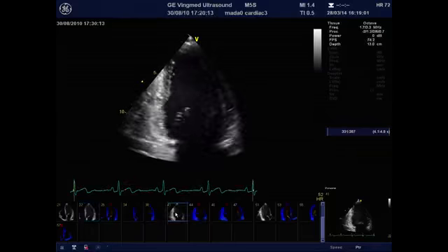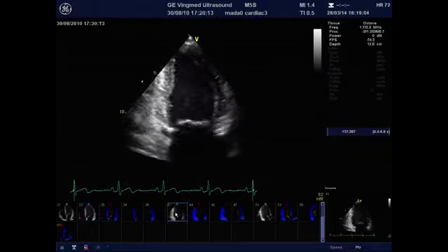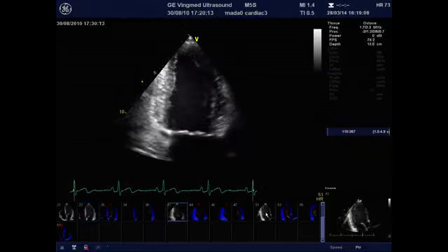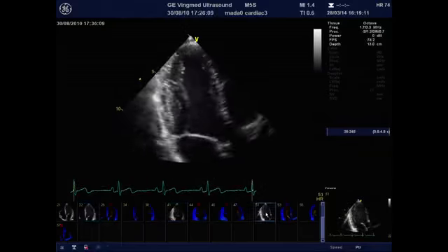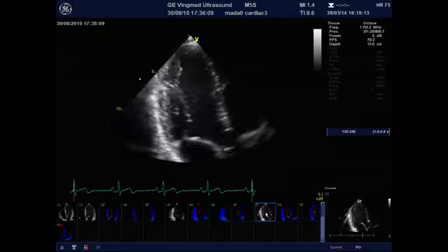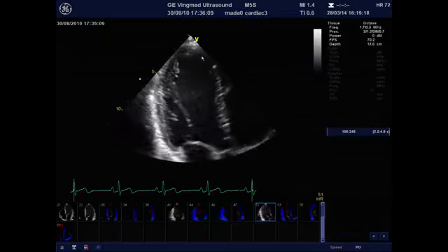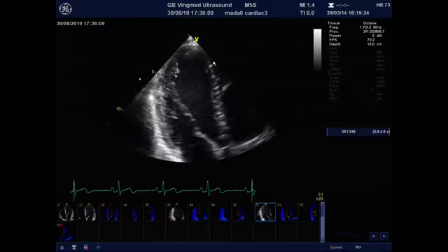As you can see here, this is a good quality image. We don't need to improve anything there. A 2-chamber view, which is also of good quality, and a 3-chamber view. You should take care that you don't have reverberation artifacts in the image. They often appear at the very apex and are stationary, bright artifacts. If you have those, you have to move your probe position a little bit to get rid of them. Once you've acquired these images, you can start analyzing already.